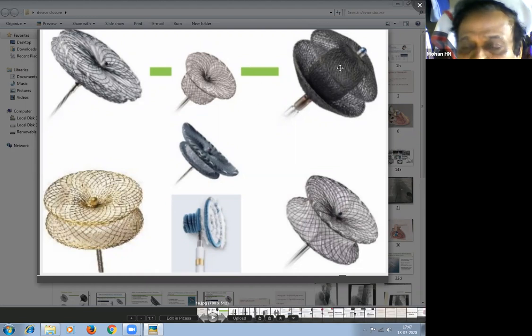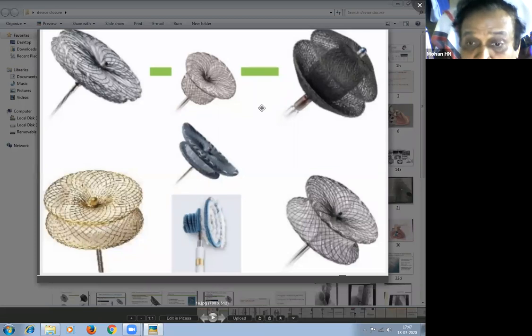So this one is about the ADO2. In ADO2, there is no fixed size. Whatever it will be, like 6 by 6, 5 by 6, 5 by 4, like that. So how is this one? First one is the size of the device plus 6 extra. Second one, 5 by 6, means 6 is the length from here to here.